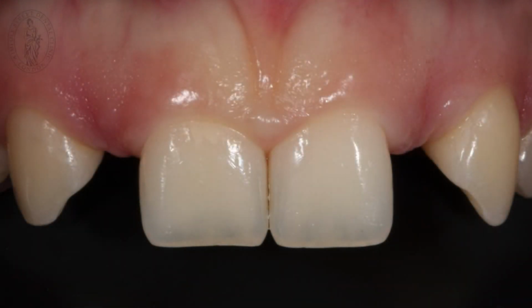Now in the next sub part of this presentation, I'll show you options in case you do not want to have implants or surgery or bone grafts for that matter, what we can do with Maryland bridges. You've seen this case as case 1 already, down below, and you can find it as well as a full case in our video library. And this is a case where lateral incisors were congenitally missing.